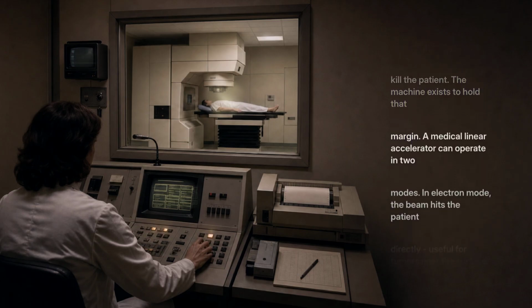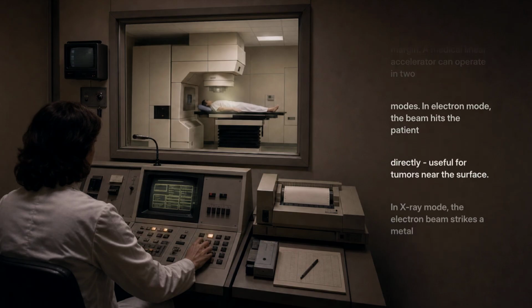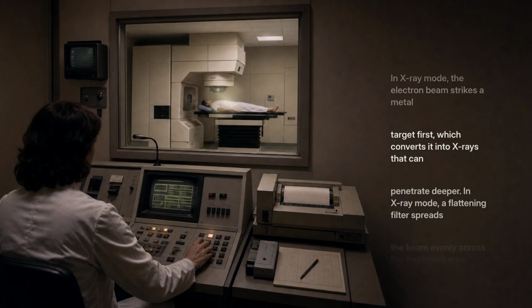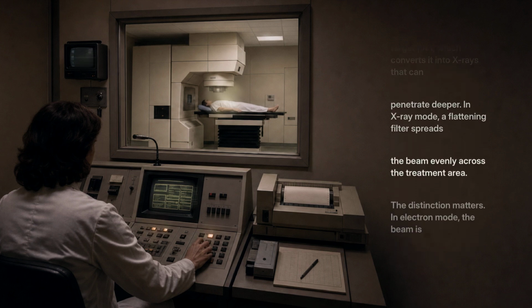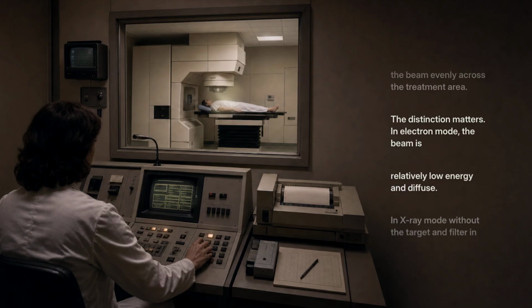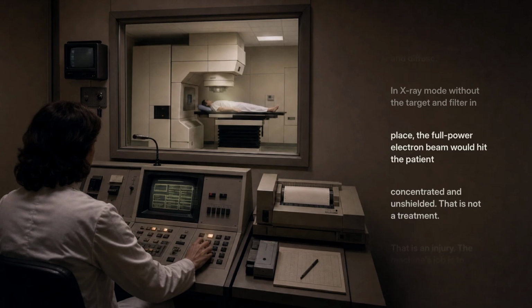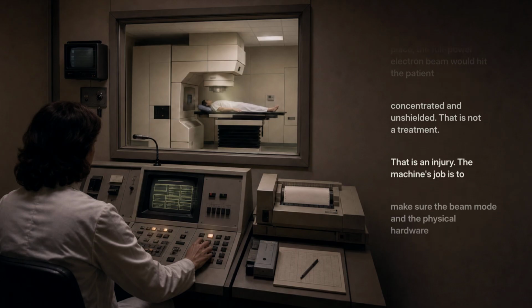A medical linear accelerator can operate in two modes. In electron mode, the beam hits the patient directly, useful for tumors near the surface. In X-ray mode, the electron beam strikes a metal target first, which converts it into X-rays that can penetrate deeper. In X-ray mode, a flattening filter spreads the beam evenly across the treatment area. The distinction matters. In electron mode, the beam is relatively low energy and diffuse. In X-ray mode without the target and filter in place, the full power electron beam would hit the patient concentrated and unshielded. That is not a treatment.